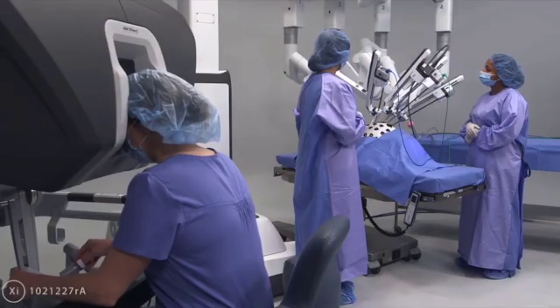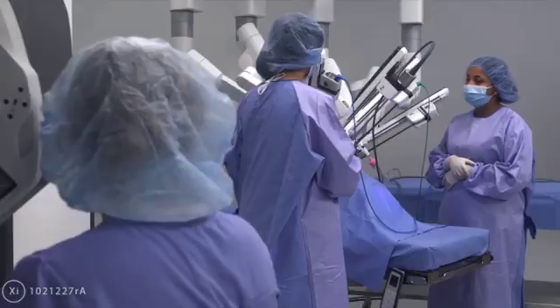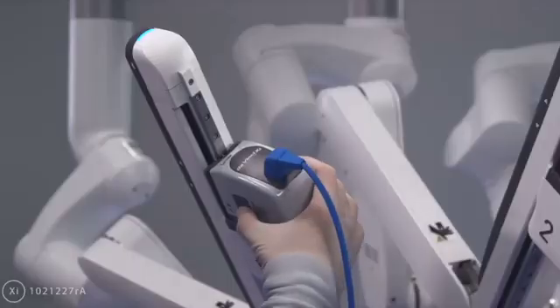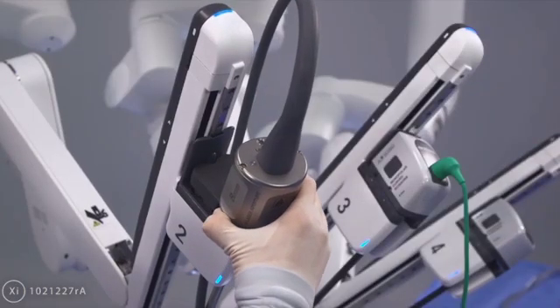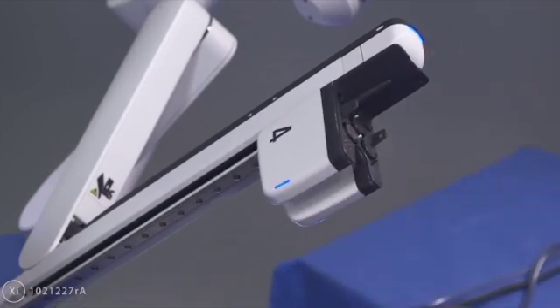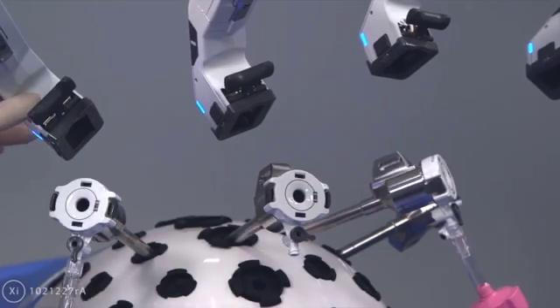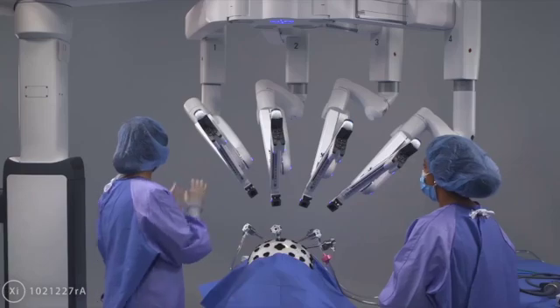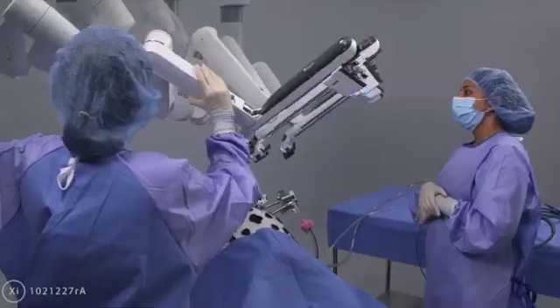When the procedure is over and the surgeon has released any tissue from instrument grips, the team is ready to undock. To undock the patient cart, a sterile staff member removes all the instruments and endoscope by squeezing the release buttons and pulling straight out and up away from the arm. Next, he or she disconnects all the cannulae from the arms and raises or repositions the boom as required to ensure the patient cart arms are clear of the patient and other obstacles.